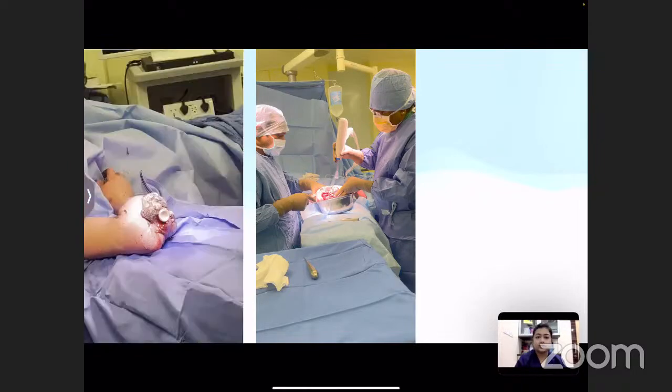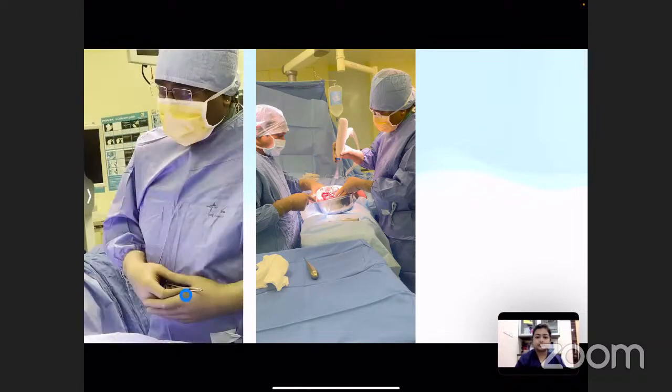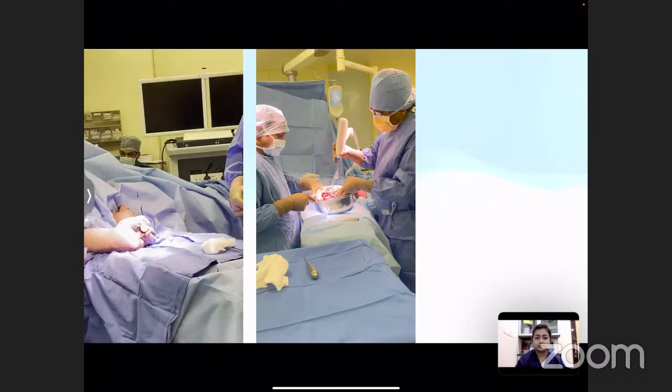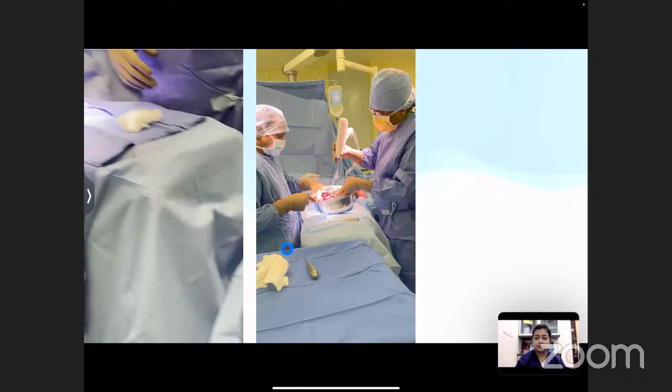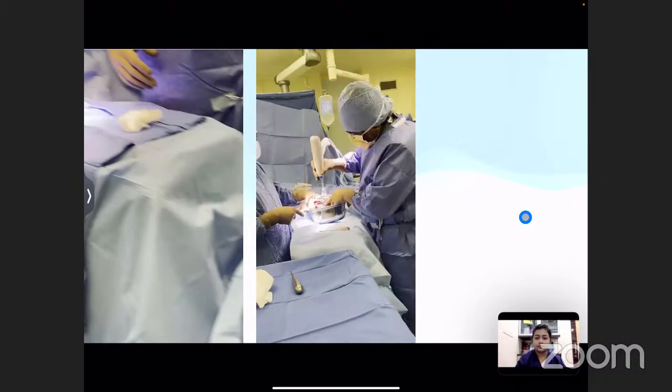Our plan is to stabilize it with Ilizarov. I'm just explaining what I'm going to do: merciless debridement, cleaning of the dead tissues, bone transport of the ulna, and later plastics to cover this. We'll see how it goes, cleaning with almost 9 liters of saline.